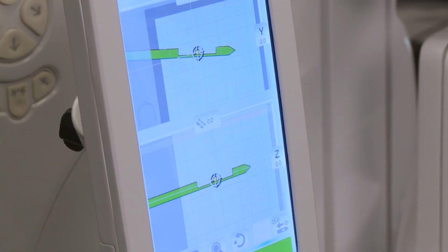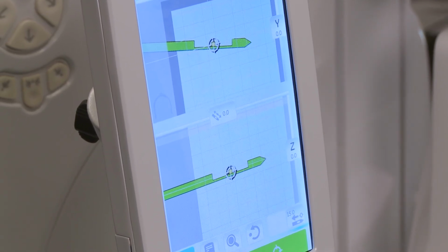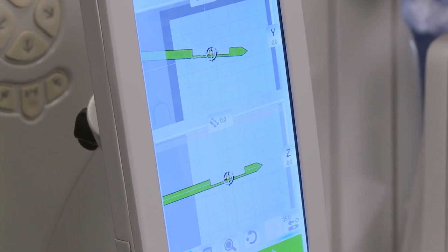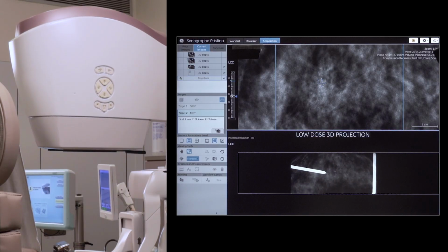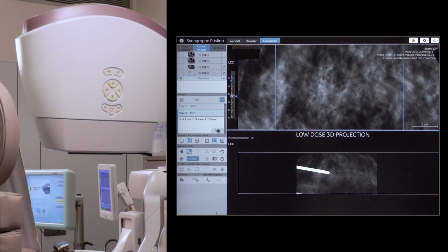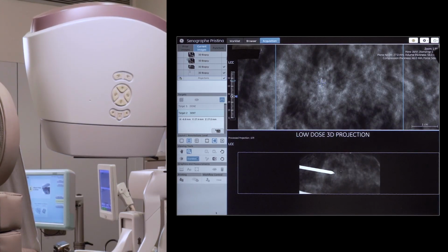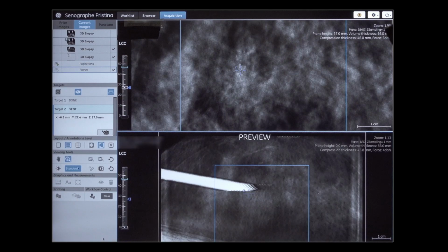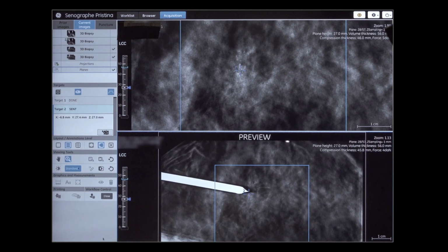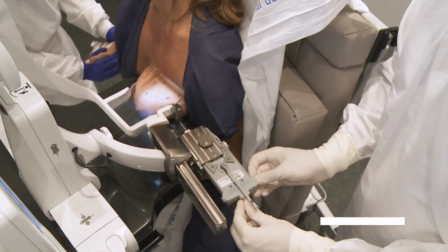The biopsy display shows the needle notch versus target when in post-fire position. A 3D biopsy sequence is taken to check the needle tip is approaching the lesion as per the pre-fire position. Once the needle tip, target and lesion are aligned, the EnCor can be fired.